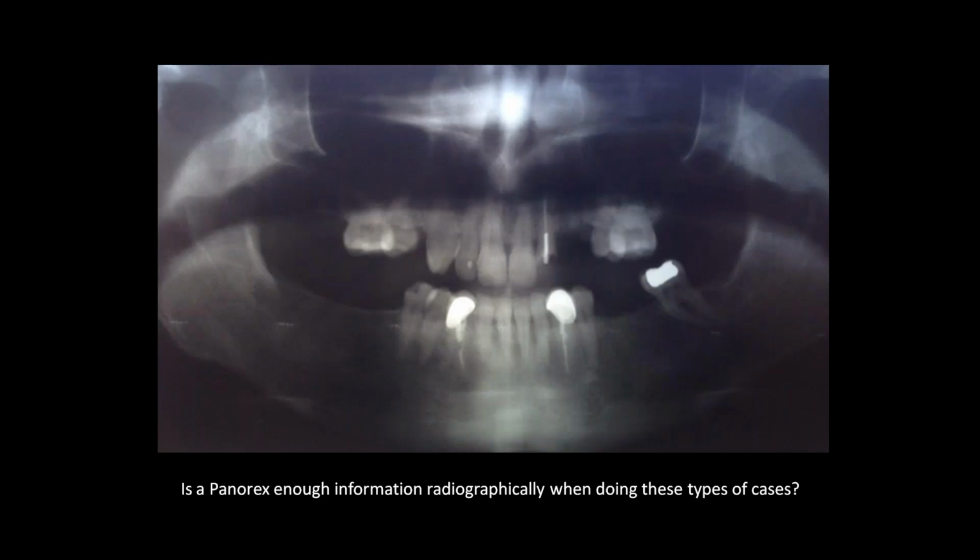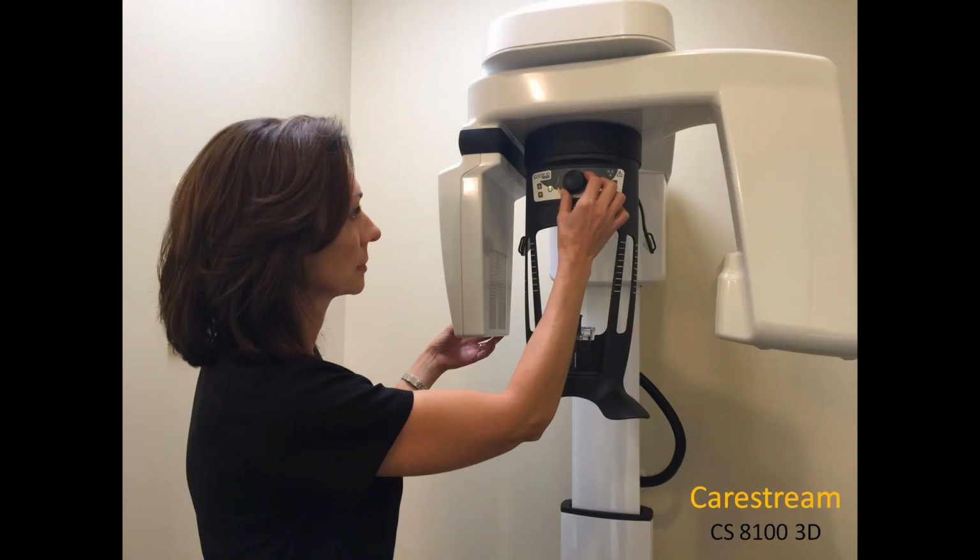So the patient presented with a panorex from his existing dentist that he was seeing, and we clearly identified that this really is not enough information to be able to provide full mouth reconstruction. So the first thing we recommended to this patient was, in fact, that we get a CBCT.